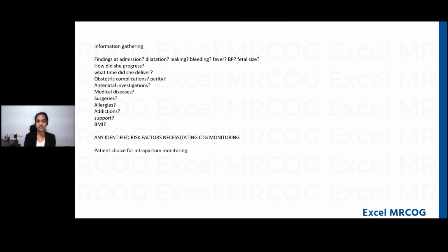Ask whether it is patient choice for intrapartum monitoring, because now the NICE guidelines mention that the choice is to be given to the patient. Even if the patient is low risk, but she chooses CTG monitoring as a way of monitoring her baby intrapartum, then you have to respect her wishes and allow her to have CTG monitoring. So this is the information gathering that you need to do in this station. Since this was not done, I cannot give you any score for information gathering, so you would get a 0.